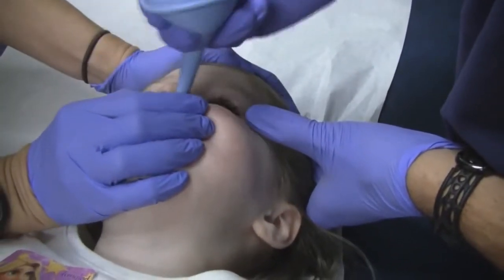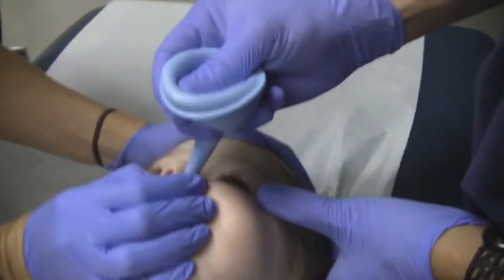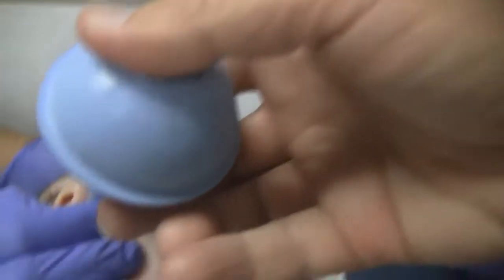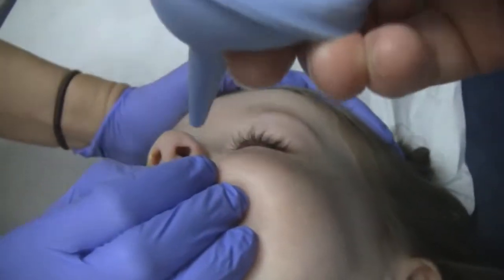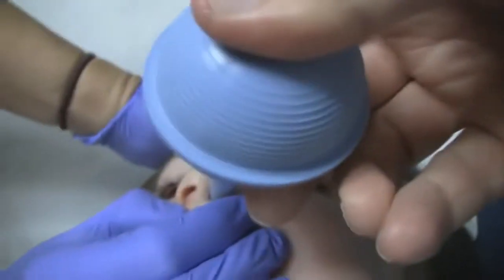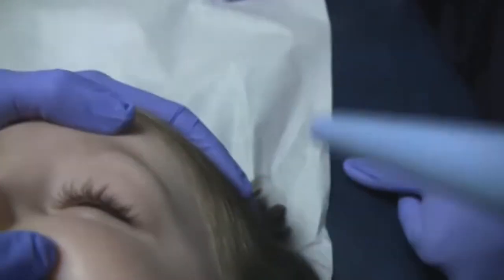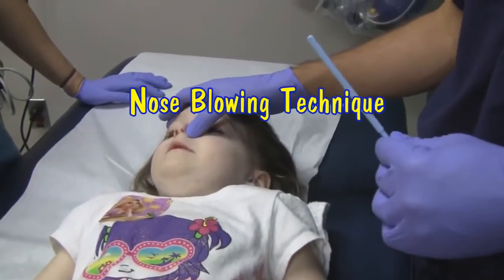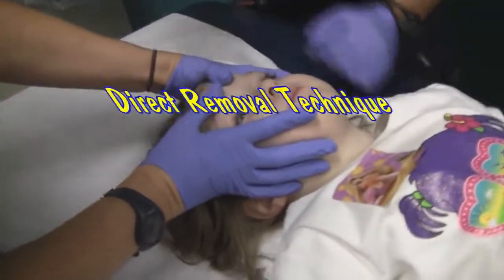That does stink. I told you. Good job. You are being such a big, brave girl. Can I squeeze for a second? Let me just try it. You're doing well. You are doing so well. You are being such a big girl. I know, that feels funny. You're doing a good job. Okay, try to hold really, really still. So you've got her mouth closed. Did it progress any at all? Blow your nose real hard, as hard as you can. You're doing a good job. Good girl. We're going to get it out.